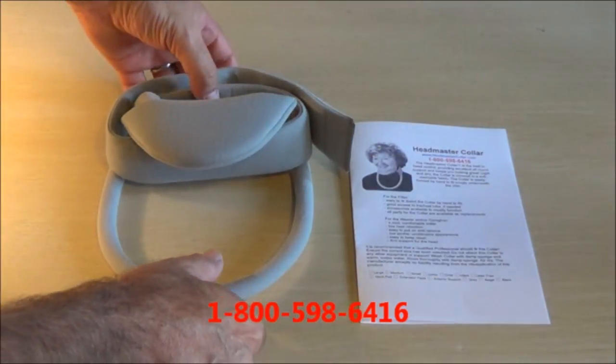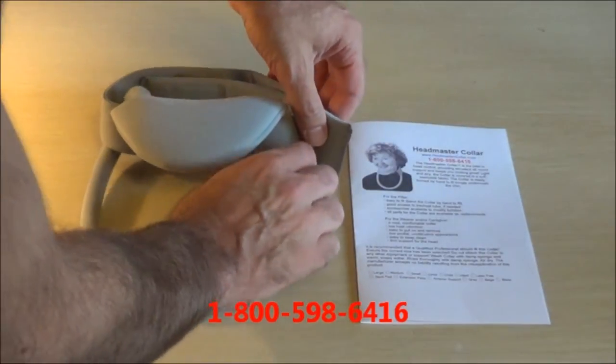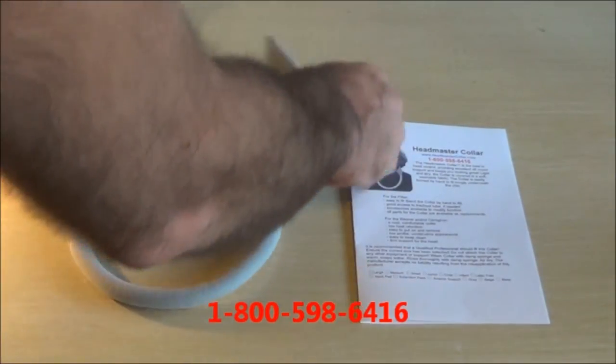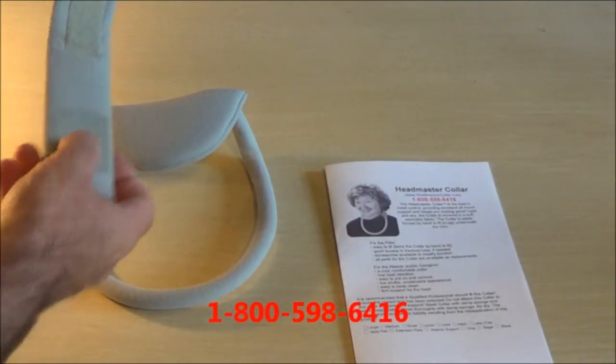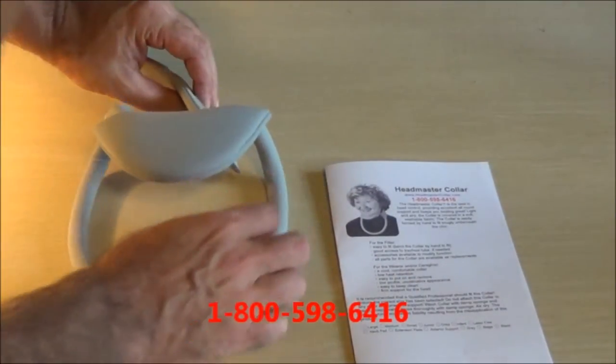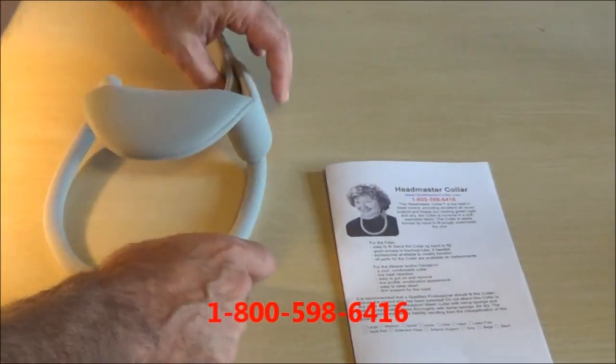A frequent question we get asked is how do you hook up the straps. So it comes basically with the straps around. We're going to have the Velcro facing the outside. One strap attaches to the one side.